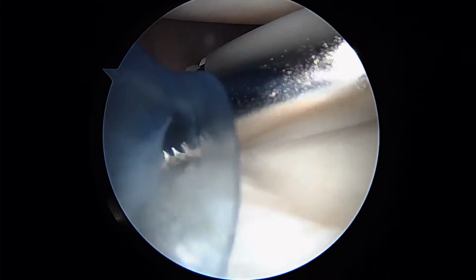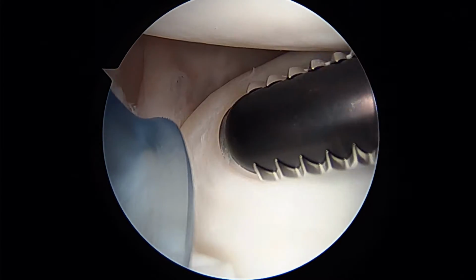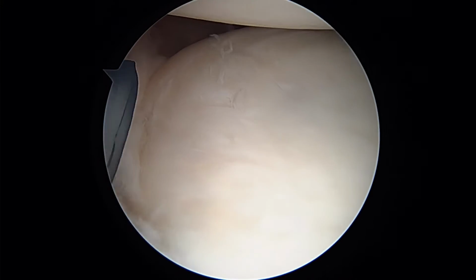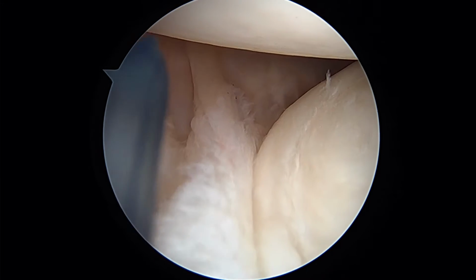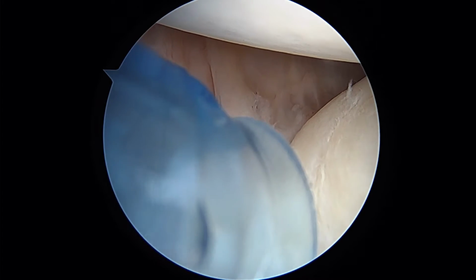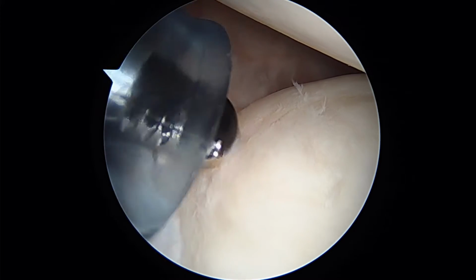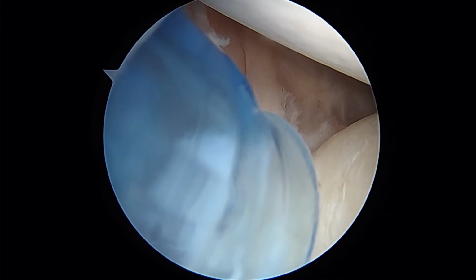I don't see a classic Bankart type of injury, but your labrum is a little bit small. Take that in the front. So there's our view down the front of your shoulder here. And I think just tightening up the anterior capsule with an anchor right about here will be a smart thing to do based on your exam.